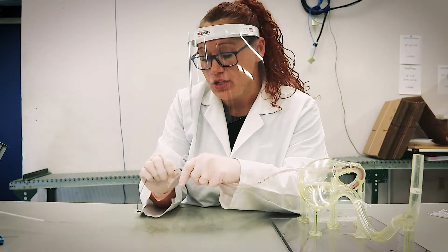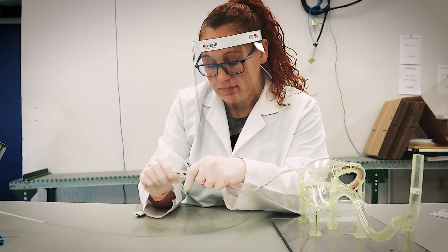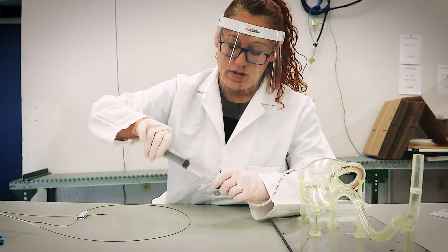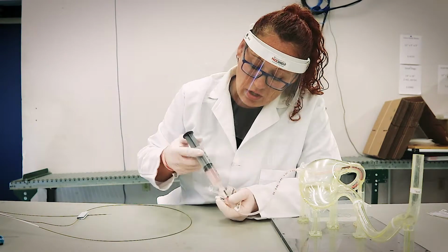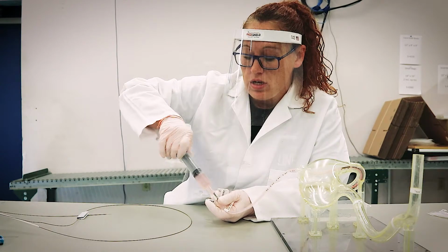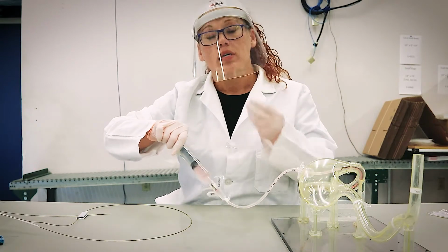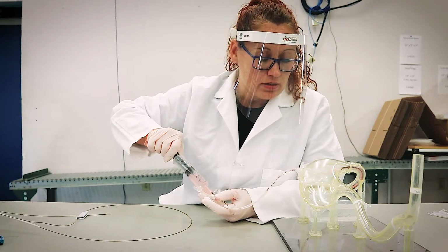It takes a lot of patience, and a lot of that flushing and aspirating, because every little bit that we knock loose, it's important to spread out and keep loose so that we can make it a little bit further each time. You just barely move it 2 to 3 cc's or mils on your syringe so that you're not applying too much pressure. It's okay to hold 10 to 15 seconds. Sometimes that slow, steady pressure allows things to move on their own in there.